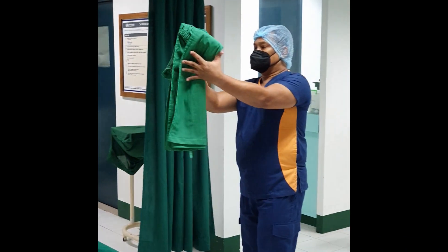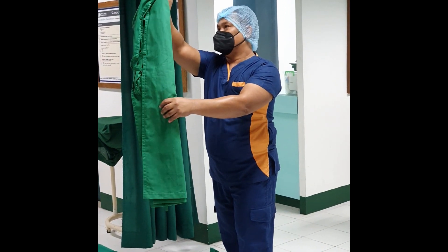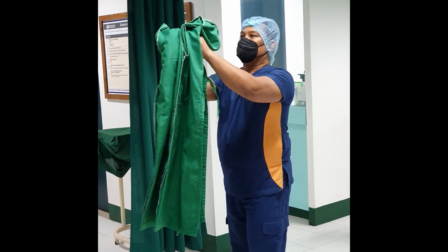Holding the folded gown at the neckline with the inside toward you, keep your hands on the inside of the gown as you let the gown unfold in front of you at arm's length. Do not allow it to touch anything.